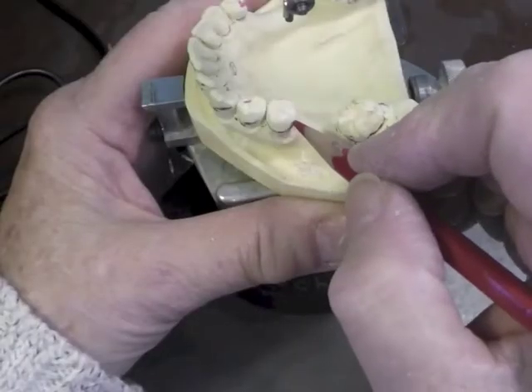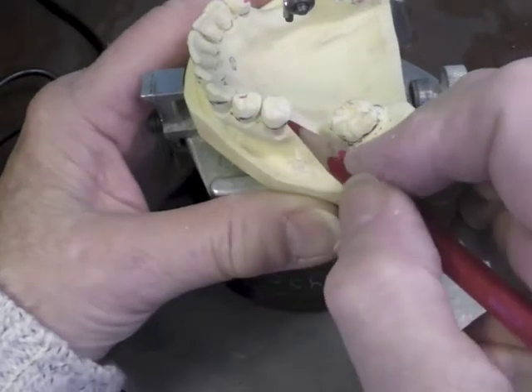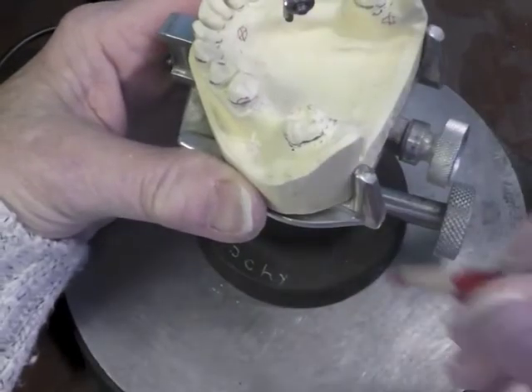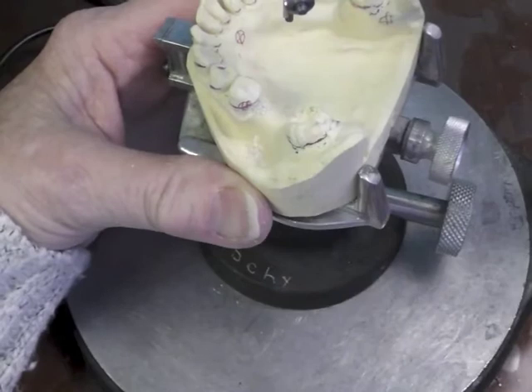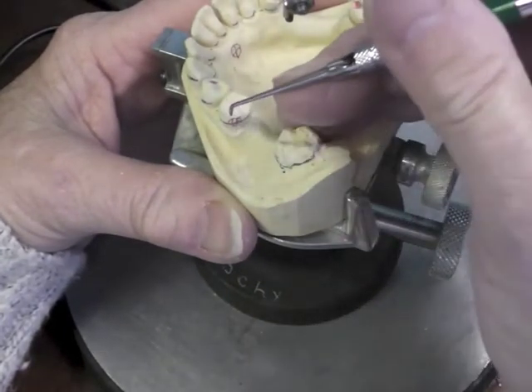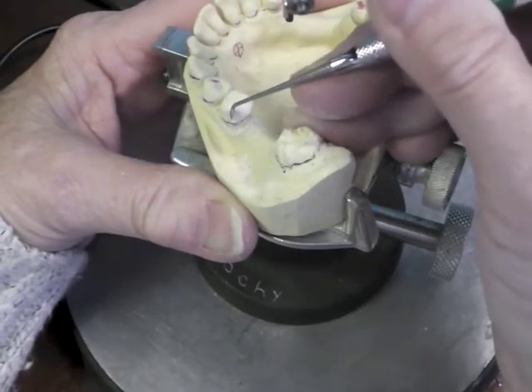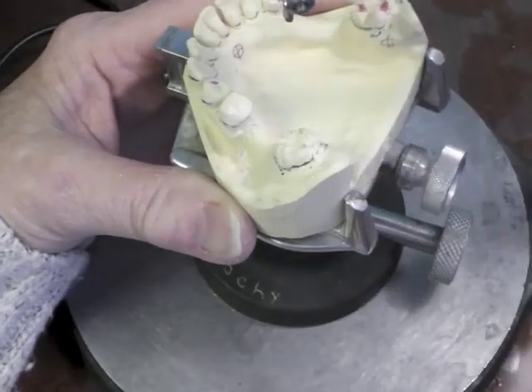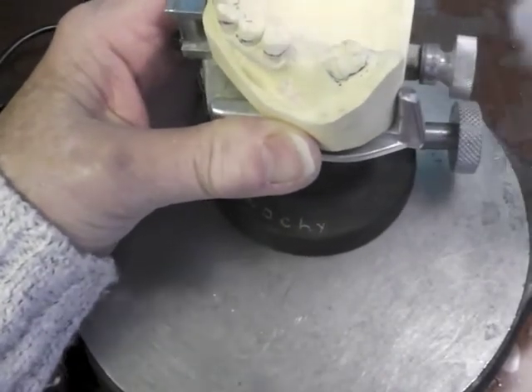My arm needs to end up in the terminal third. I'm going to alter this a little bit right in here and lower my survey line. I could have indicated this at the time I did my survey. So I'm going to lower my survey line a little bit right through here, and I want the arm to be above the survey line, in the middle third of the tooth preferably. I'll check to see if I've lowered my survey line, and I have.